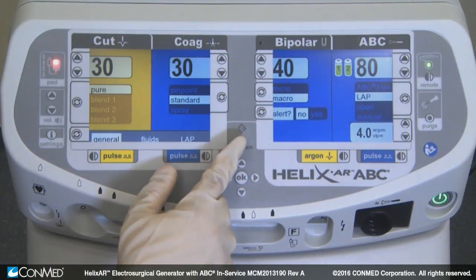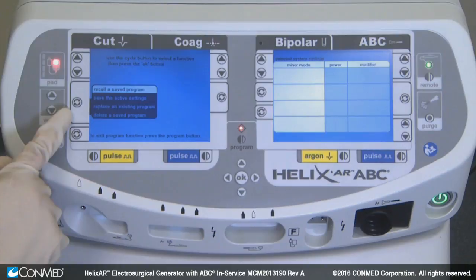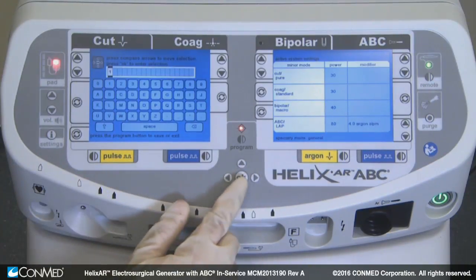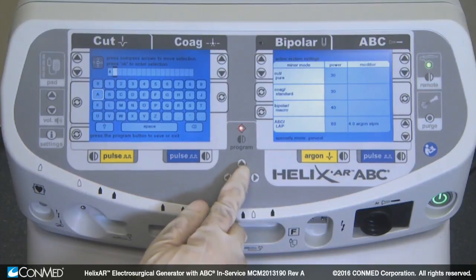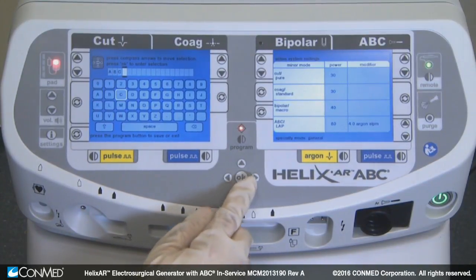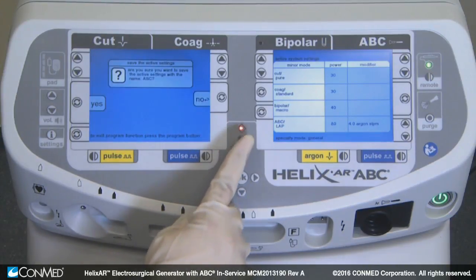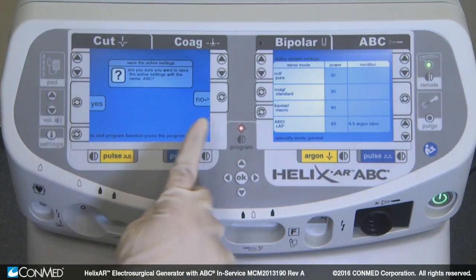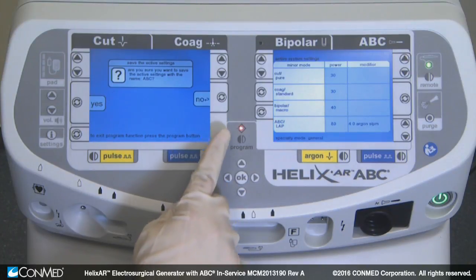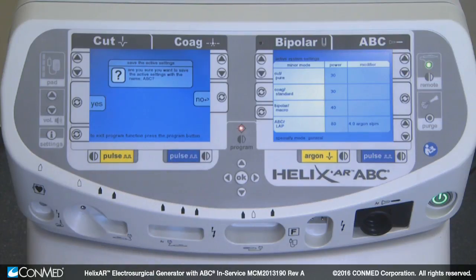To save your current settings, first push the program button. Then select Save the active settings and press OK. Use the navigation arrows and OK button to name the program. When satisfied with the program name, select the program button. Choose Yes to confirm, or No to return to the previous screen. Press the program button to exit program mode without saving a program.